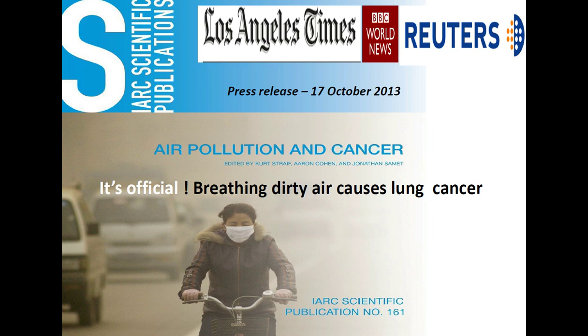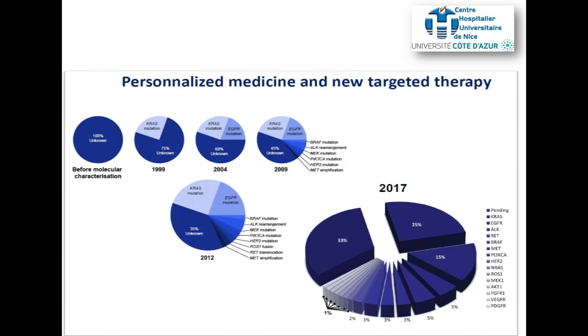carcinogenic factor. The introduction of targeted therapy into the clinical management of lung adenocarcinoma has had a massive impact on patient care, with the discovery since 2004 of an increased number of genomic alterations. Consequently, mutational analysis is critical in 2017 for treatment decision in clinical routine practice.